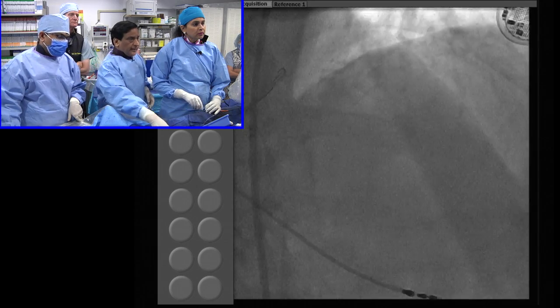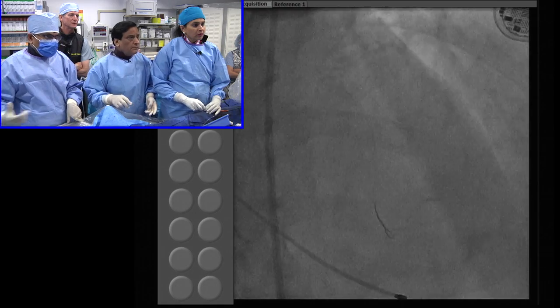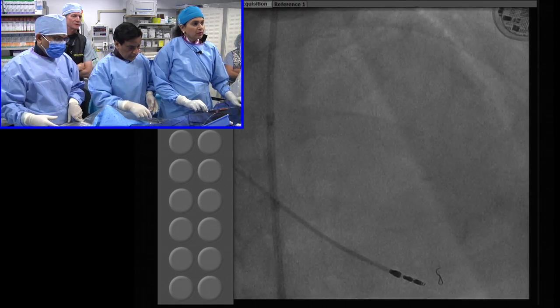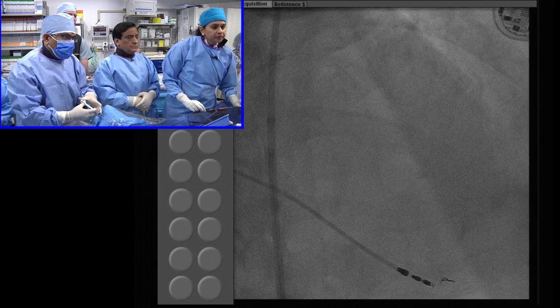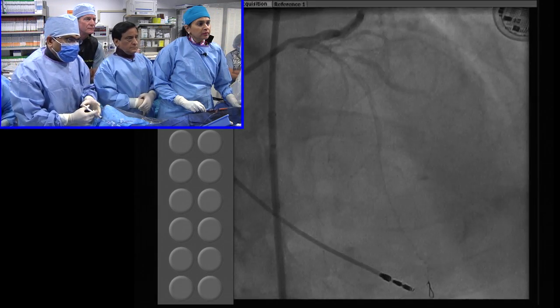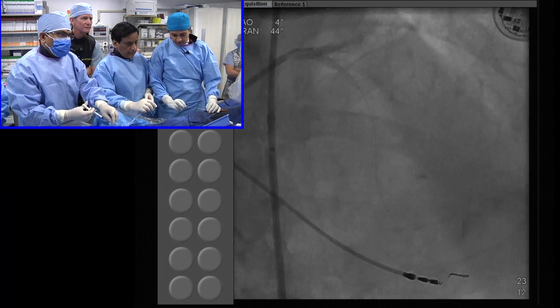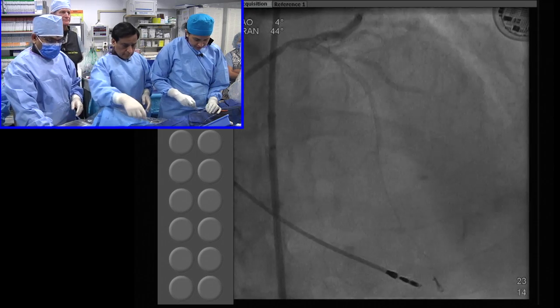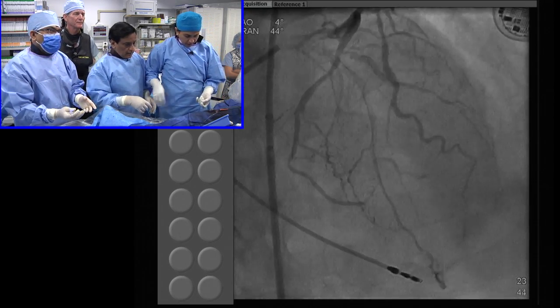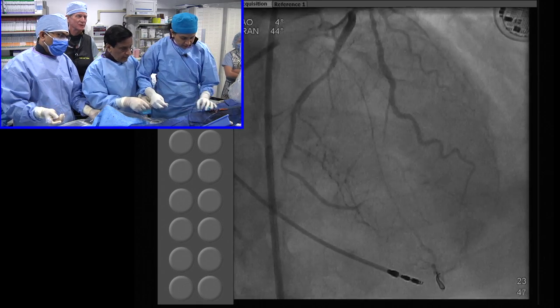And don't worry about the side branch now, main vessel only. We got a new run through. Maybe take a quick picture to make sure the diagonal's okay. Ready? Good. Nice. The side branch diagonal looks okay. Very nice work. We suspected that. A lot of nice demonstration of tips and tricks.